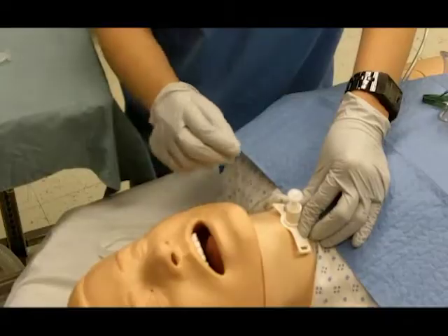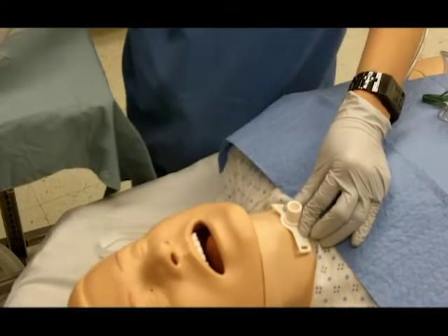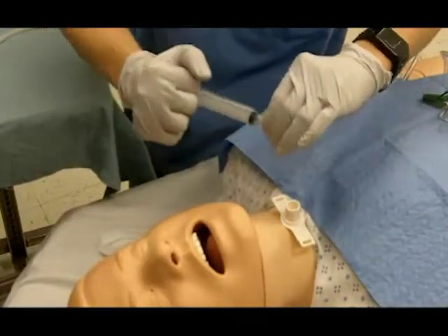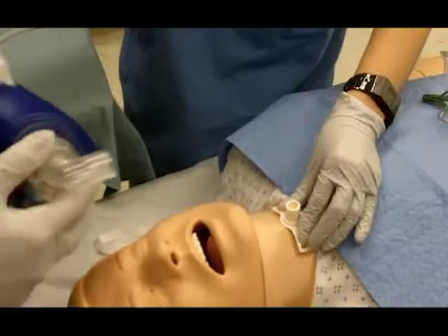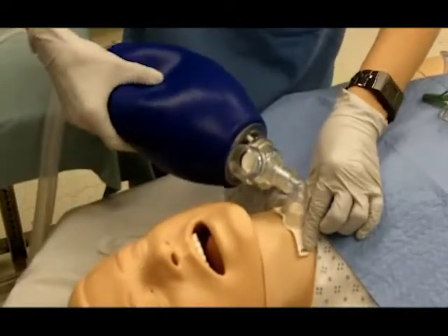Once the tube is in place, remove the obturator as this will obstruct the air passage. Inflate the cuff and ventilate the patient. Secure the tube with trach ties or sutures.